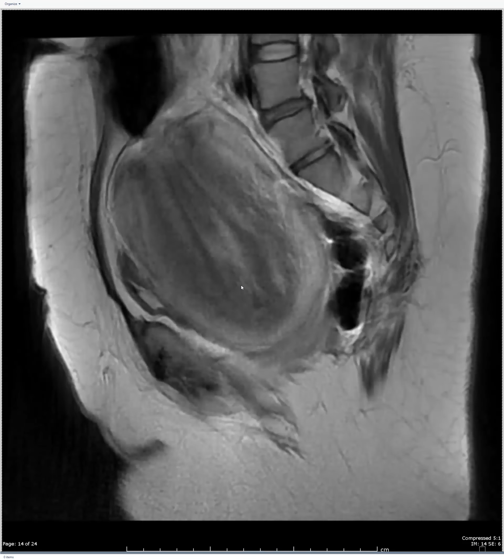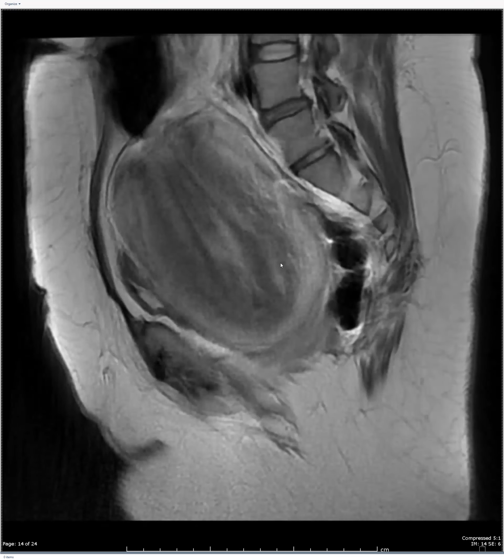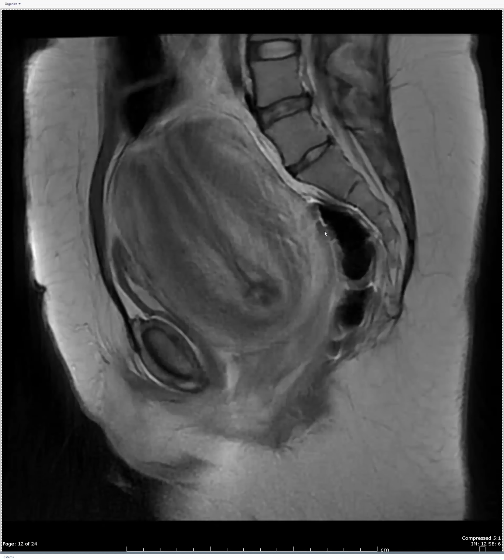Yeah. So this is a very good case of complete uterine inversion, which is a surgical emergency with very high 24-hour mortality. So essentially the fundus of the uterus herniates through the cervix into the vaginal canal. And there's different grades based on how much herniation occurs. You can have incomplete uterine inversion where the fundus just herniates into the endometrial cavity. And this is a case of complete uterine inversion where the fundus herniates directly into the upper vagina. And that's likely what they were seeing intraoperatively.